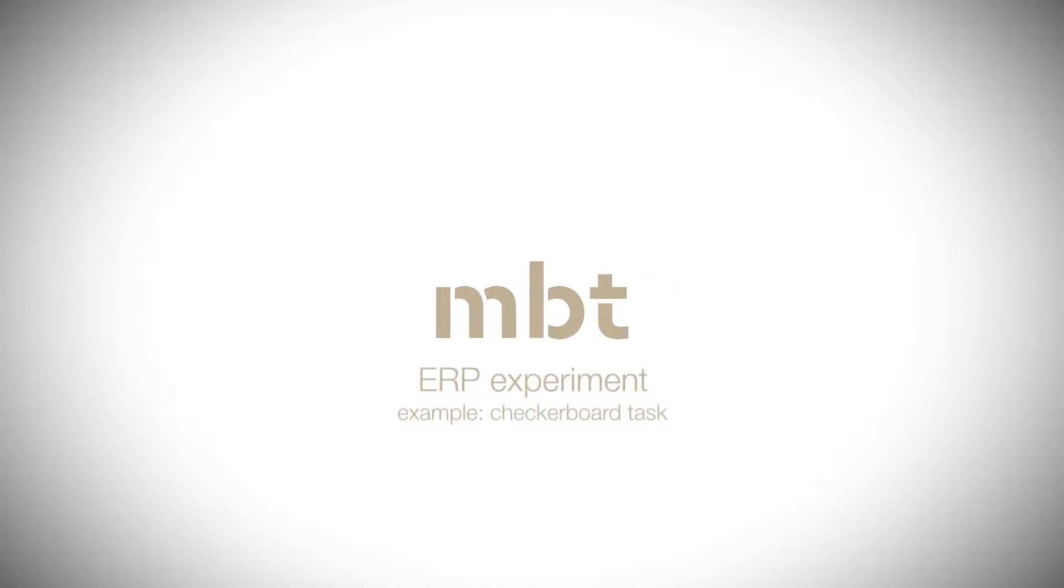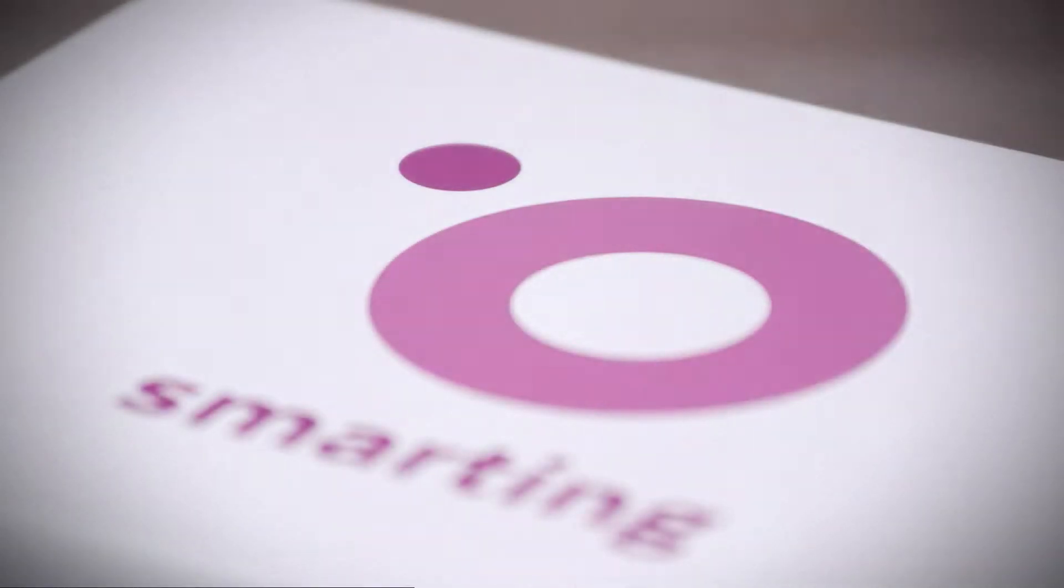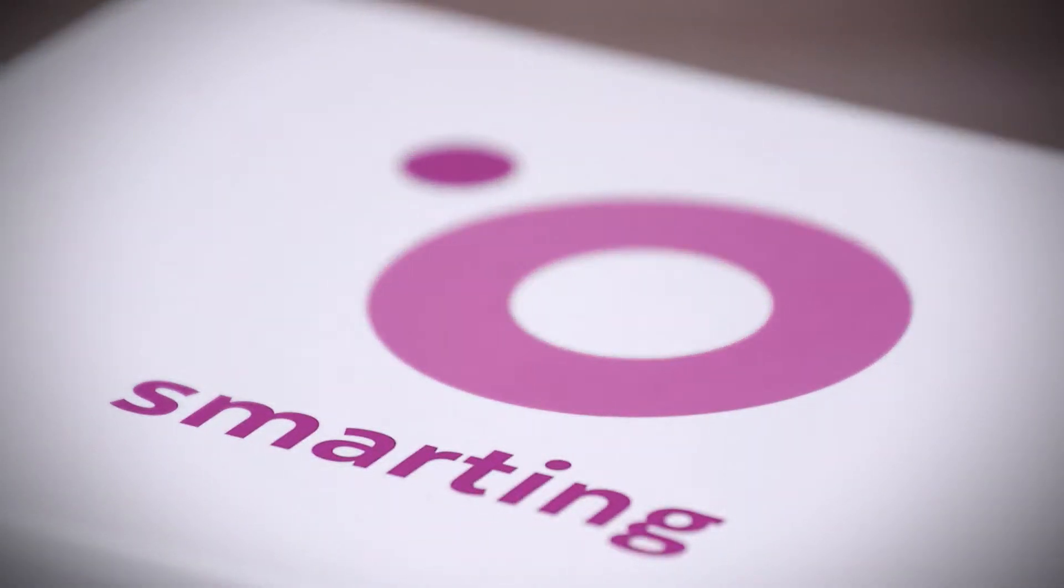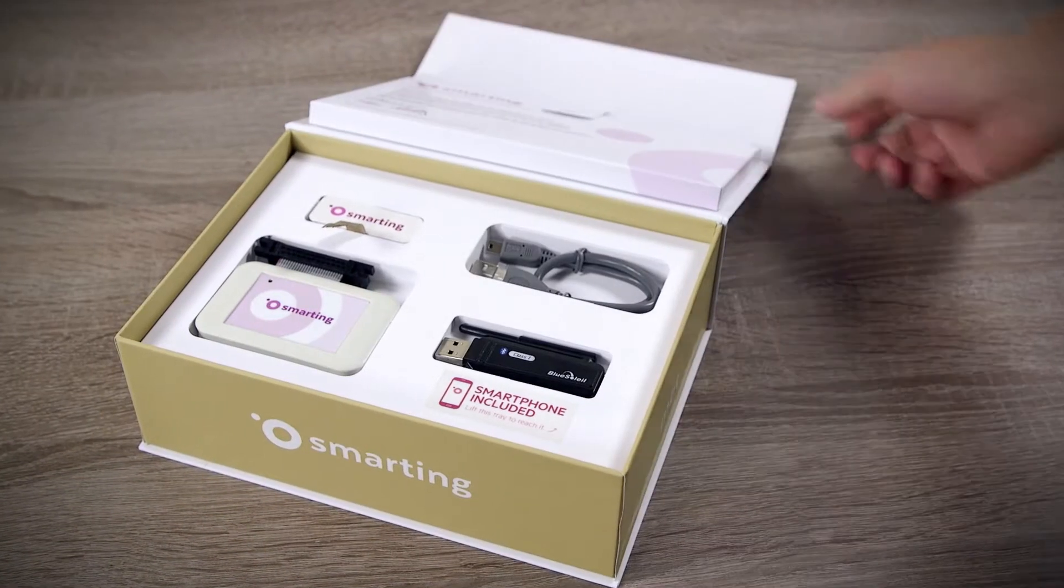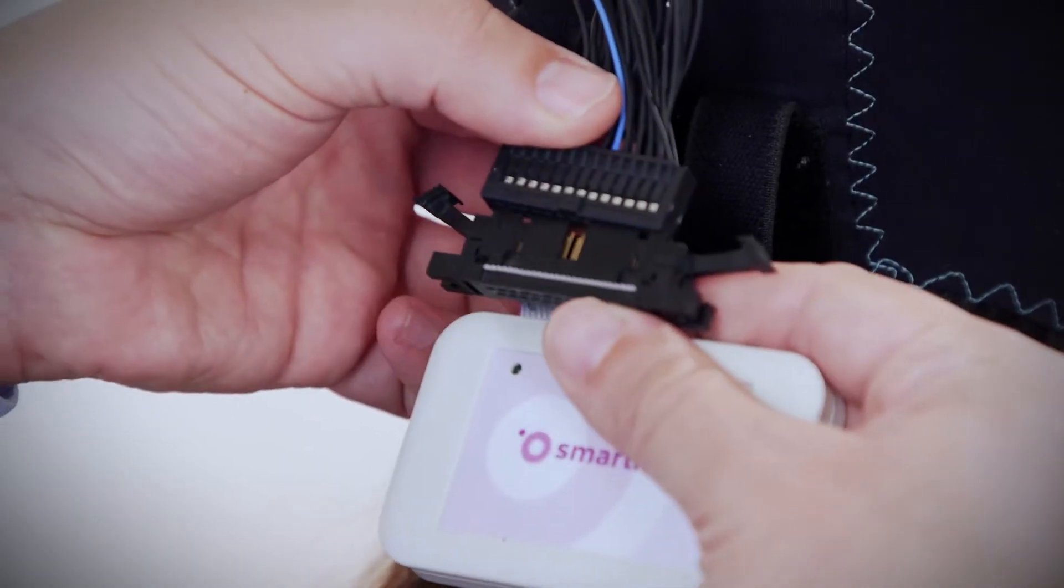We will demonstrate wireless triggering through an example of an ERP experiment with Smarting. This is a concept of fully mobile recordings, so we use no wiring for the stimulus delivery.